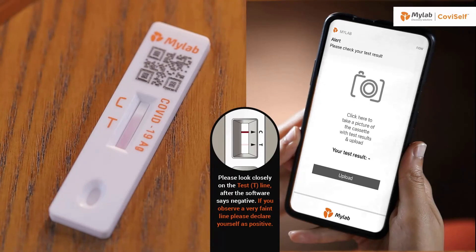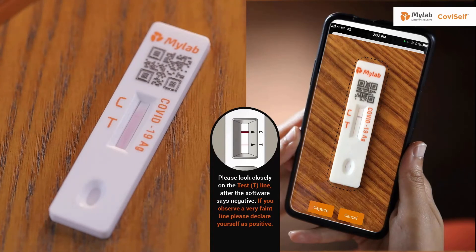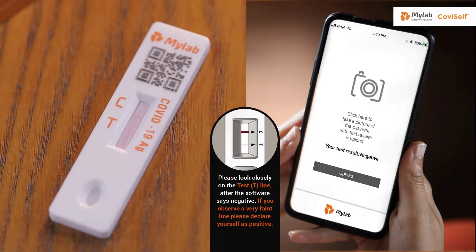At 15 minutes, the MyLab CoviSelf app will raise an alarm. The software has an intelligently designed AI which gives accurate results. You can now download your COVID-19 report from the link.